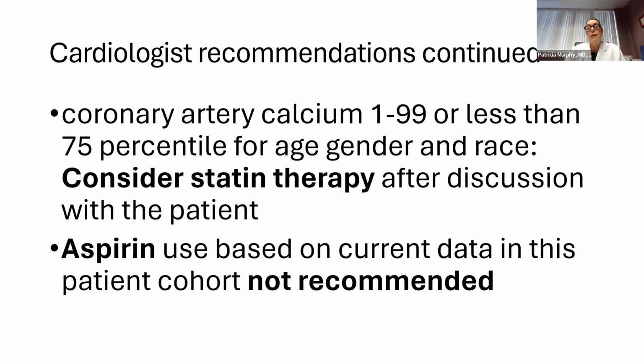The data may be less definitive, but many people will elect to take cholesterol-lowering medication once they discover they have plaque in their heart arteries. But importantly, aspirin use based on current data in this patient cohort is not recommended. So if your score is less than 100, you might be considered a candidate for statins, but we don't recommend aspirin. And you don't have to remember all this, but it is important to realize the subtleties.